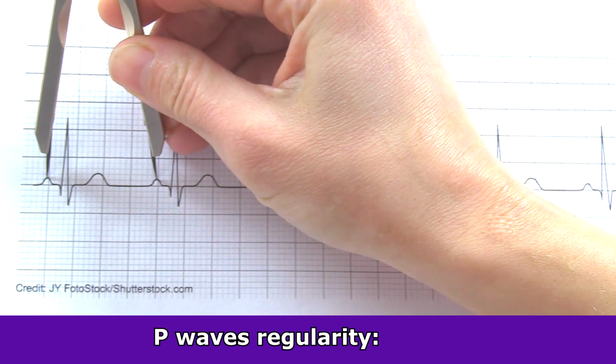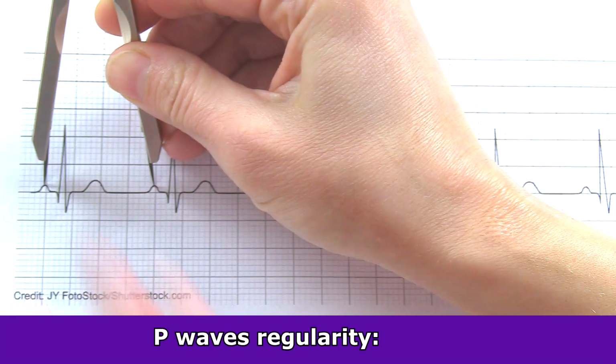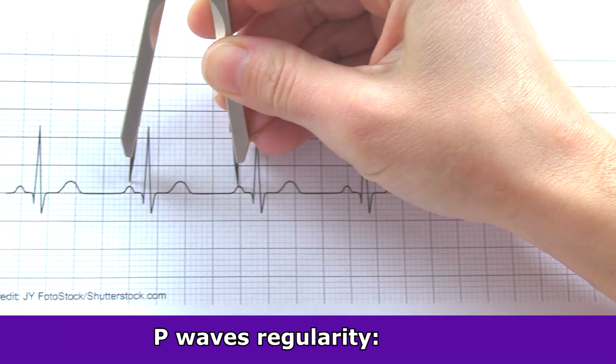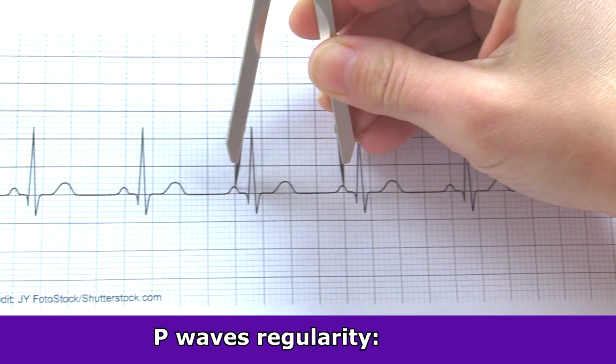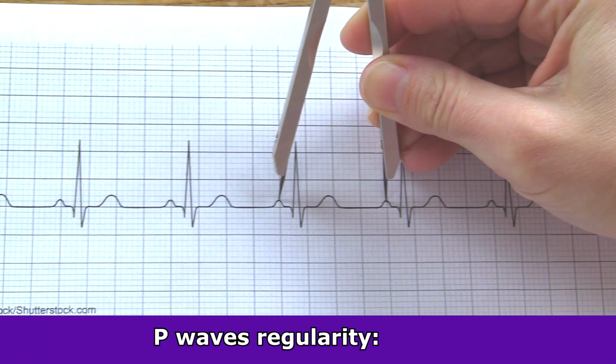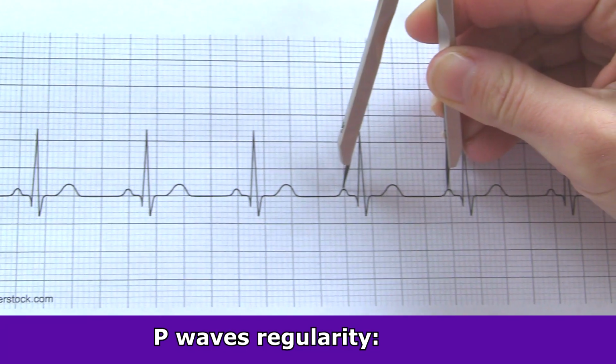And then what we're going to do is just go down through the strip and make sure they have the same distance within them. So here we go, making sure that they line up. And so far, they have the same distance.